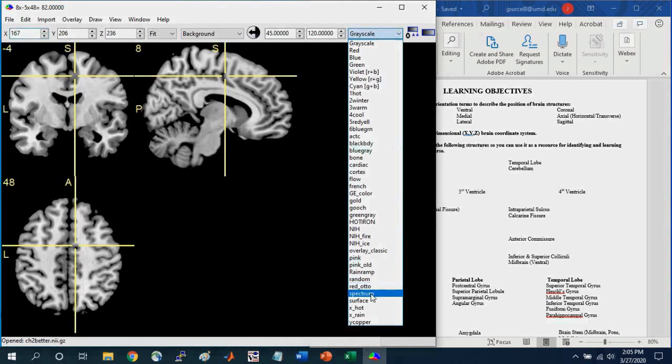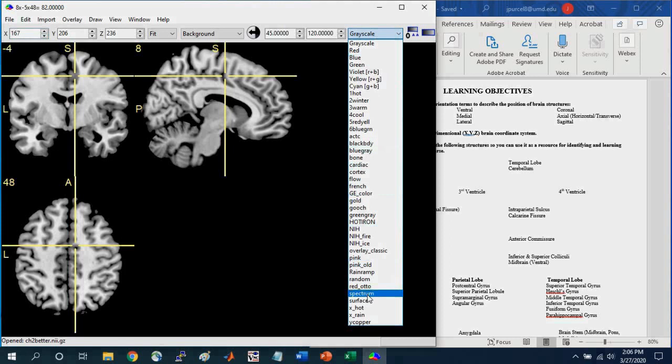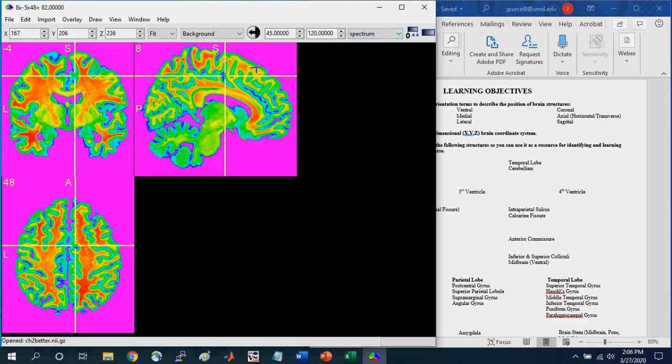And to highlight this point is you can select the grayscale and go down to select a different color scale. And just for playing around, we can select the spectrum.